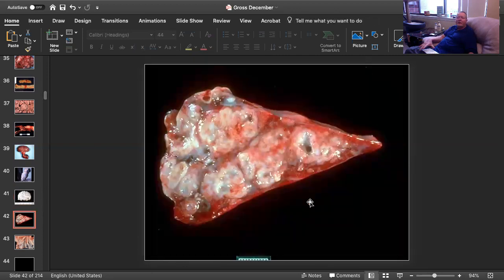Slide number 9 is tissue from a foal. Can you give me a morphologic diagnosis, a cause, and give me another affected organ?